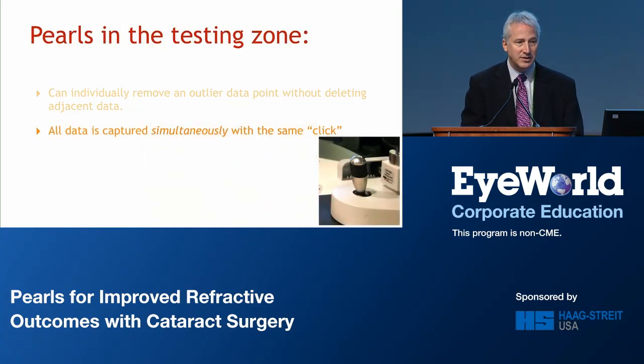So one of the pearls for the testing zone is that all of the data is actually captured simultaneously with the same click of the button. And that's very important. We're going to get back to why that's important a little bit later.